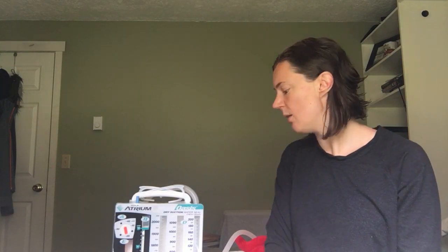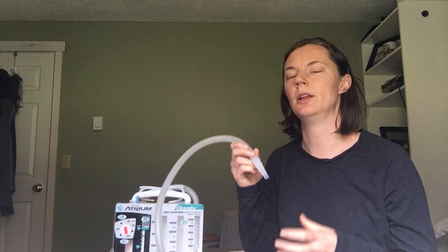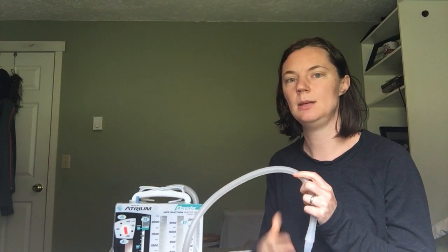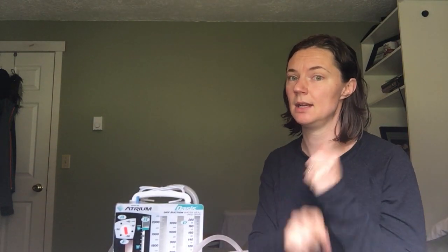Call if your chest tube comes out inadvertently, meaning the tubing comes disconnected. If you have sterile water, sterile saline, and a graduated container available in the room, you want to put that end into sterile water real quickly to keep the same amount of suction going, not the end that's in the patient, but you want to keep that negative pressure going. If it's going to take you a long time to gather those supplies, just gather the supplies to clean it and stick it back together, and then call the doctor, because they need to order an x-ray and see what's happened and if it's working adequately.